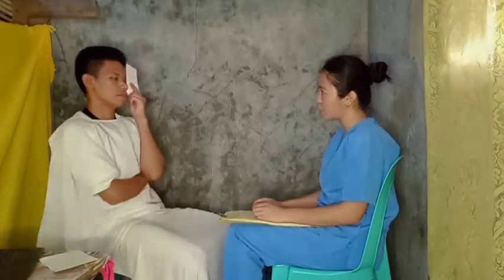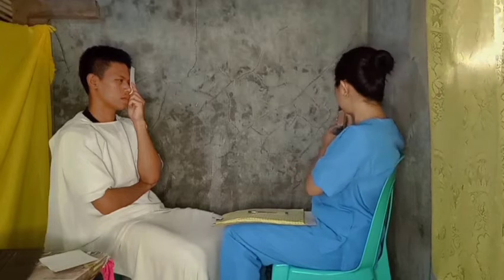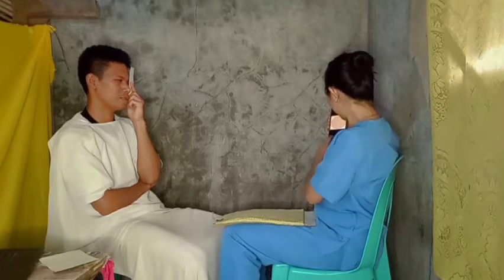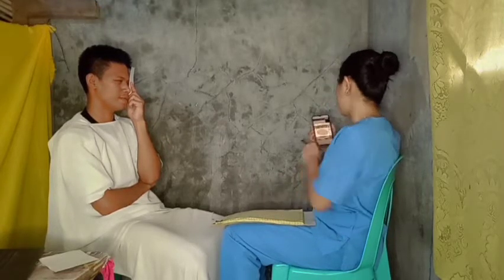So next is your right eye, sir. Okay. Sir, kindly. 6. Okay, thank you, sir. 26. Okay. 3. Okay. 97. Okay, that's good, sir. 16. Okay, thank you, sir.